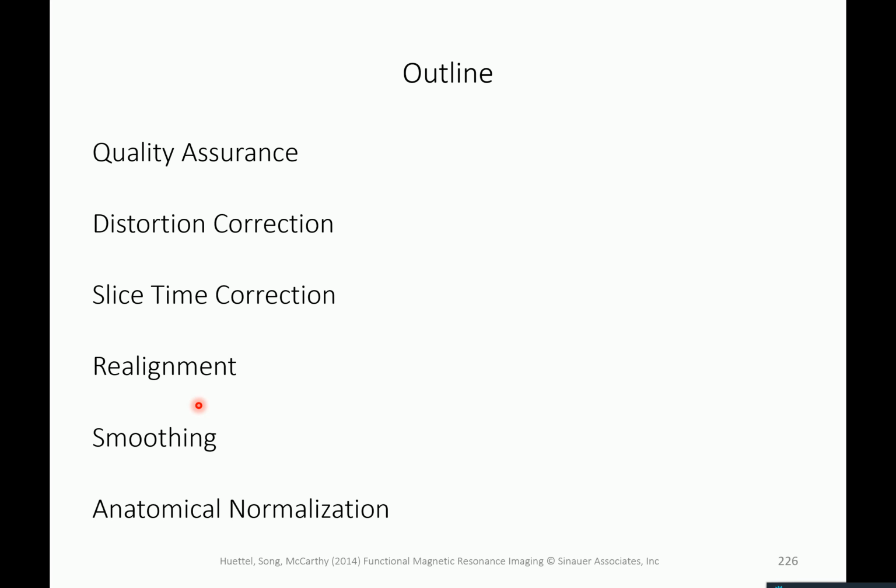Of course, you want to do everything in scripts so that you don't do things manually again, and maybe change the preprocessing a little bit and see how strongly it affects your final result. Never do one preprocessing, get one result, and then start fiddling with the preprocessing and then with the statistical analysis. This often happens, and it delays everything and takes all the fun out of things. So look at preprocessing in a very pragmatic way. If you do the preprocessing differently, your final results will be different because you do a different analysis.